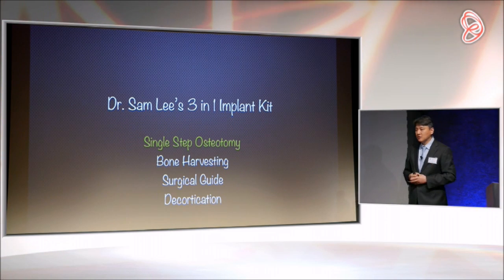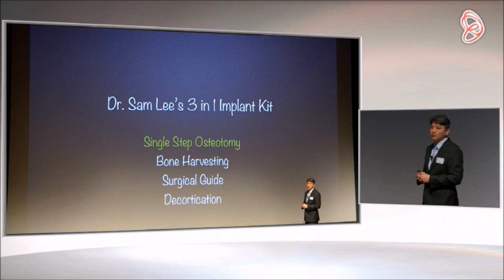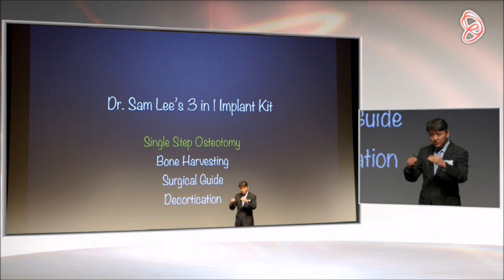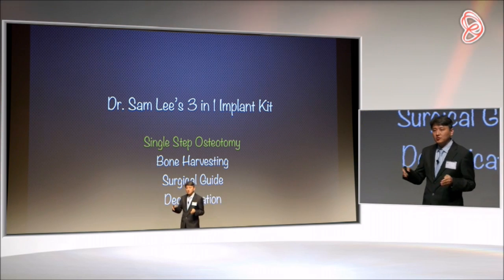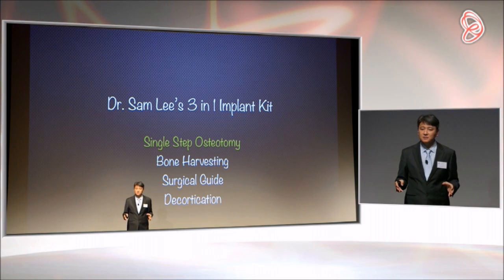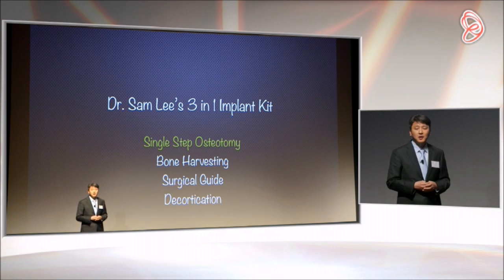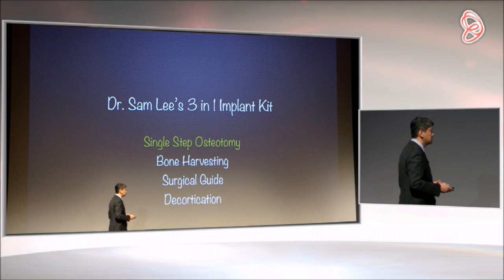Now, when it comes to dental implants, Branemark taught us that we have to use multiple drills in order to reduce heating of the bone, to reduce the temperature of the bone. But when we use multiple drilling sequences, there is more chance for us to make a mistake. Also, Branemark taught us to use a lot of irrigation, and Eriksson and Albrektsson also published that at greater than 47 degrees Celsius, the bone becomes burned.